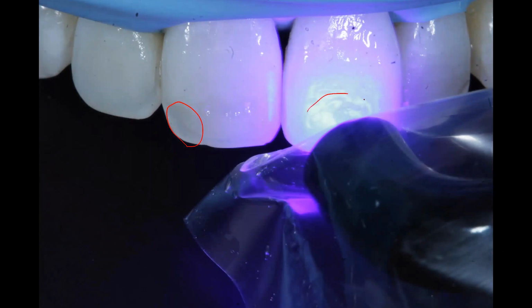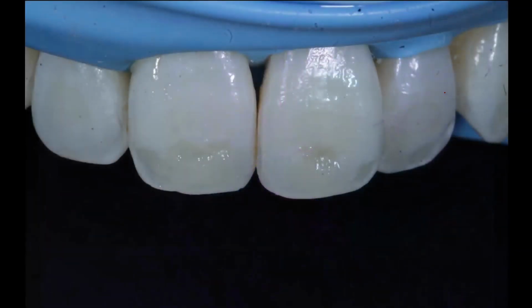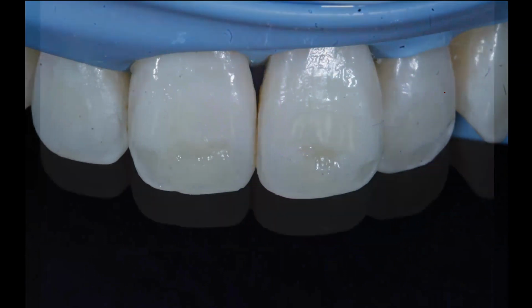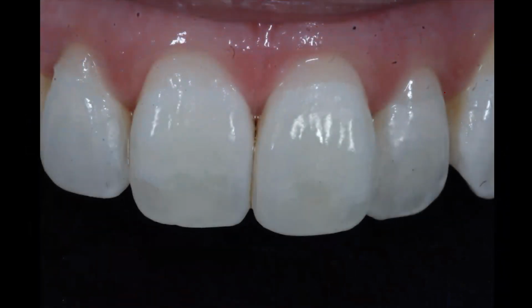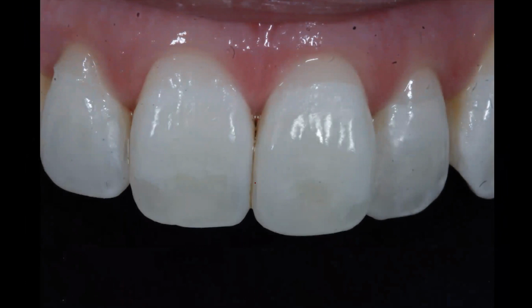infiltrant. So you'll see these areas here. Just did a little bit of microabrasion and took off a few microns of enamel there. And then we're able to infiltrate. So we did our infiltration, and I used floss and cotton wool to remove the excess in this situation. Then, because of the areas where I had actually removed a little bit of enamel, what I went on to do was add some composite resin, just an enamel shade, microfill or something along those lines. Will do quite well for that.